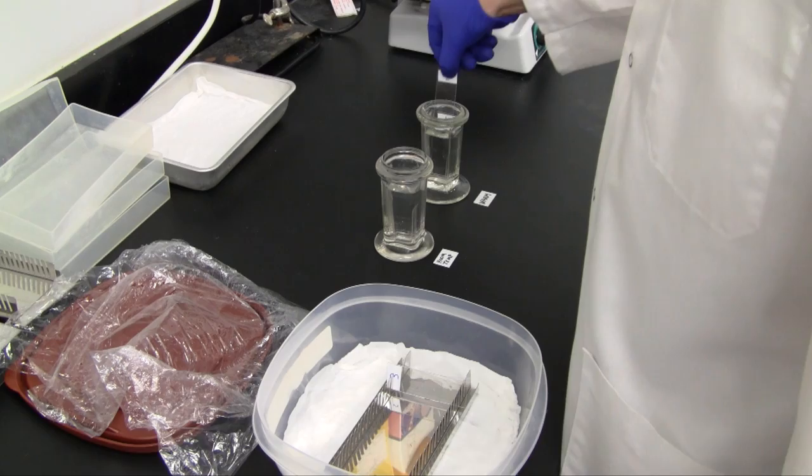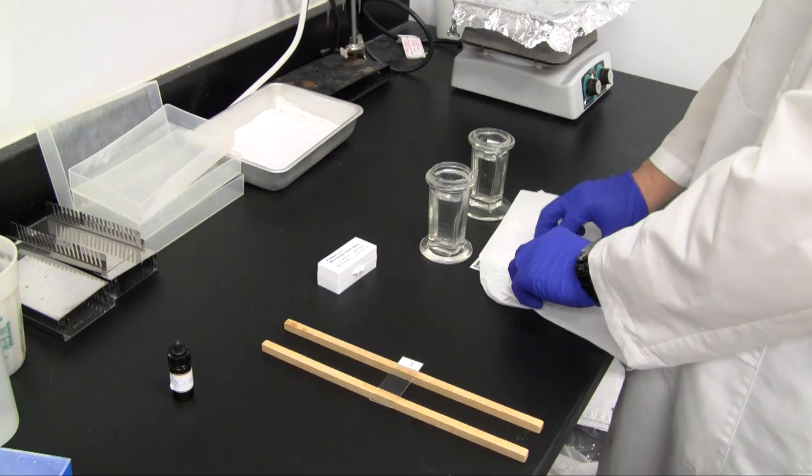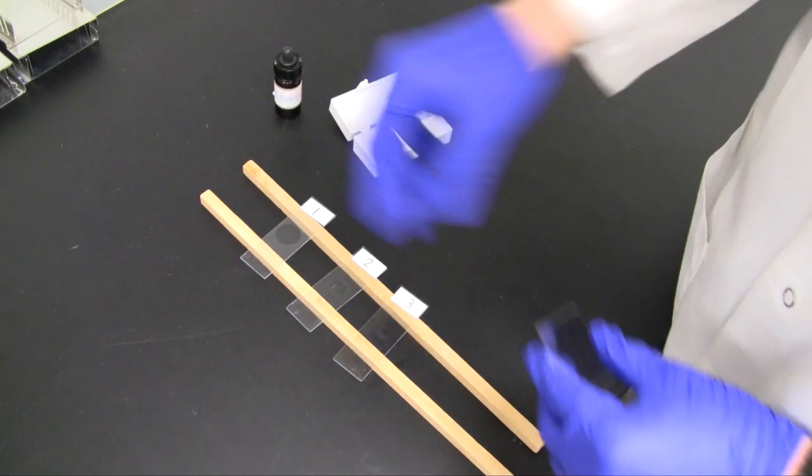After washing, the slides are briefly shaken off and the backs padded dry on a chem wipe before being transferred to an elevated surface. A drop of mounting medium containing DAPI is placed on each slide and then covered with a glass cover slip. Plain mounting medium is used if a blue probe is in the hybridization cocktail. The slides are now ready to view.